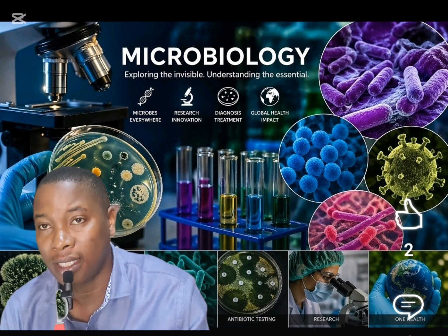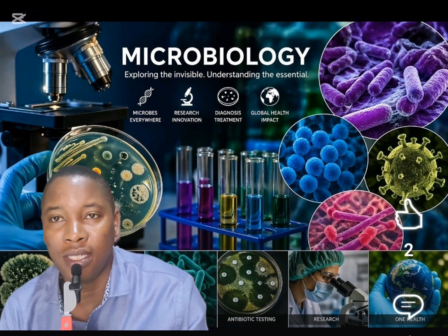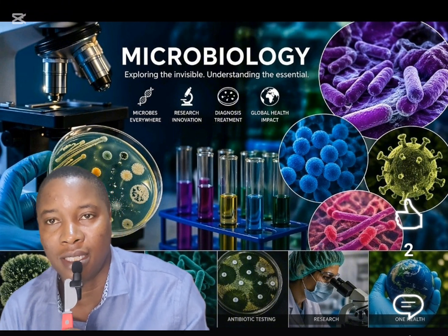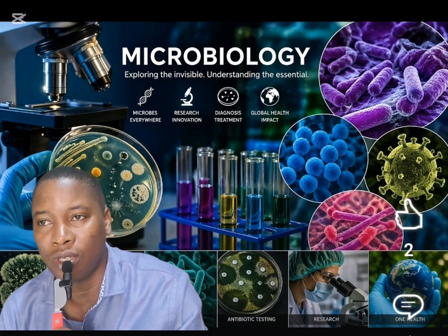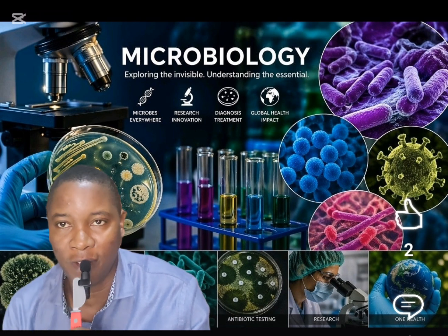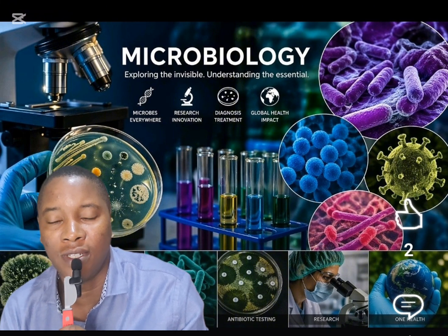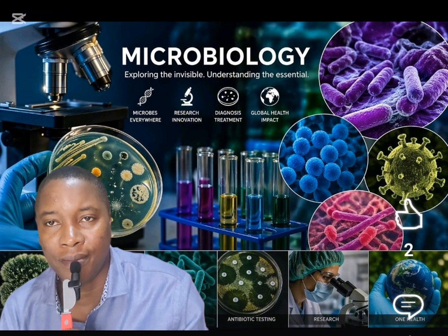There are standards that we use to read these discs. There's a CLSI standard, Clinical and Laboratory Standards Institute. They have a standard. I think the most recent one is 2024 or 2025. So we use this to read out of this, understand.